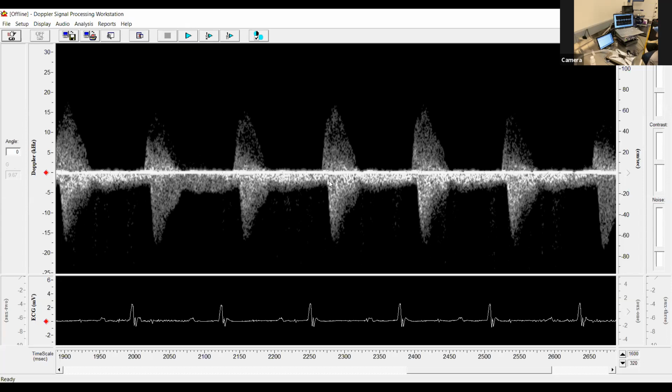Did we want to do any other flows? I can't think of any that we've covered. Sure. So we'll try the mitral flow again.